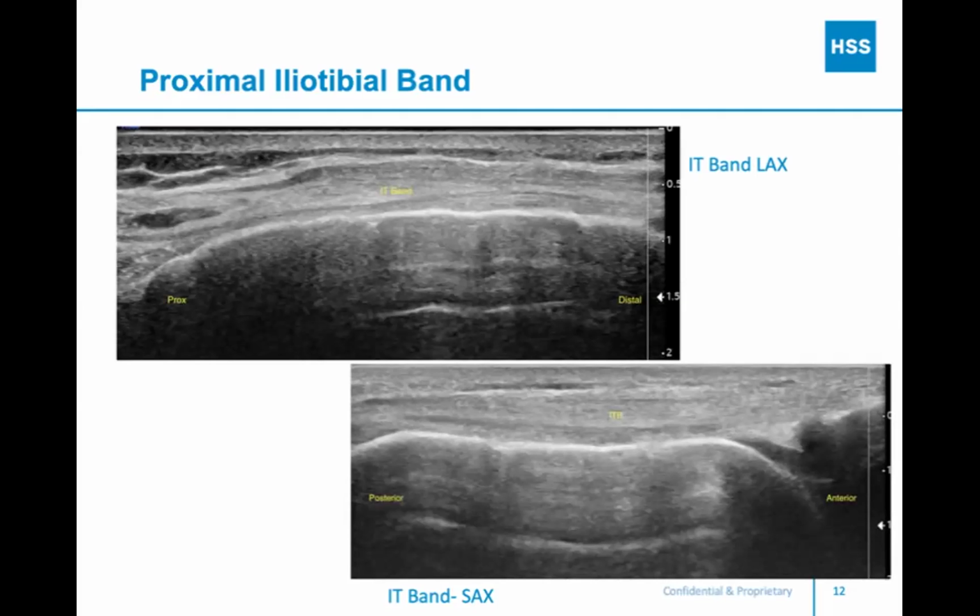I think the pillow in between the knees is a great idea. If you're having a really hard time scanning the lateral collateral ligament because you can't get it under tension, the other thing you can do, if people are in that supine position, is put them in a frog-leg position. It becomes a little bit awkward to get your transducer on there because you're holding it obliquely against gravity. But that LCL is really easy to palpate. It's tight like a guitar string in that figure four position. So it's easy to find it clinically and then put your transducer on there to understand what that structure is doing under tension. That's just another LCL trick because that structure can be really difficult to visualize.